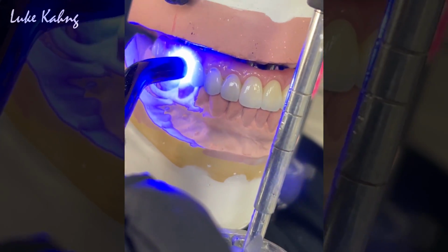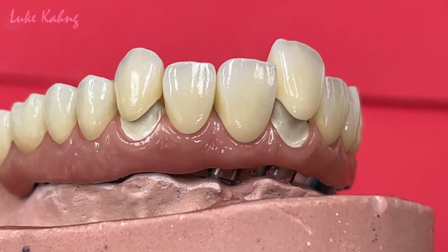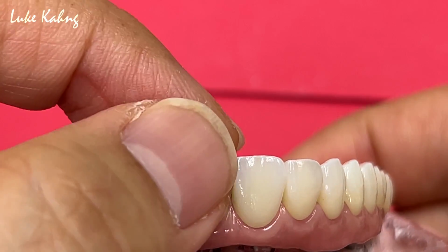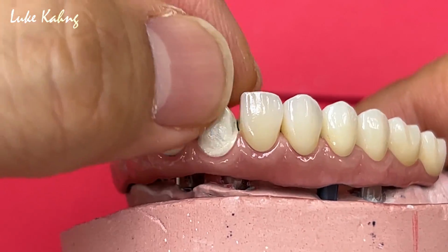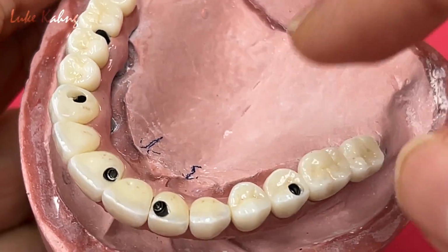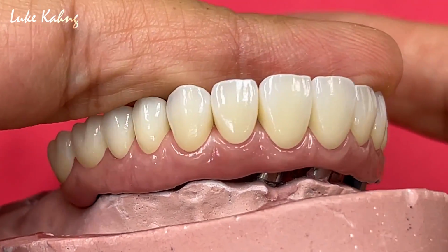Okay. So now is the curing time for this. This is individual as well. It's excellent. Now this is the final. So another Cyton 7-star case, individual crowns one by one. Let's concentrate on the margin, integrity, better translucency, surface textures. Have to be careful about the access holes. This is thin, too thin. So when we cement, we have to be really careful about that one. Anyway, before I cement, this is what the final looks like.